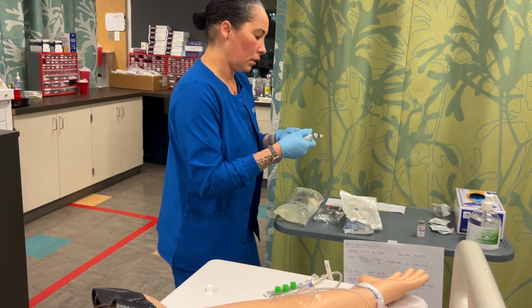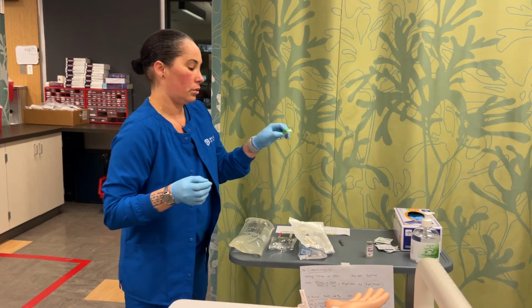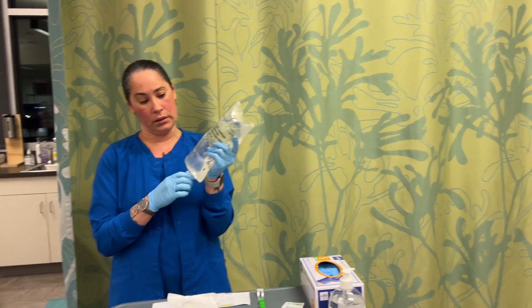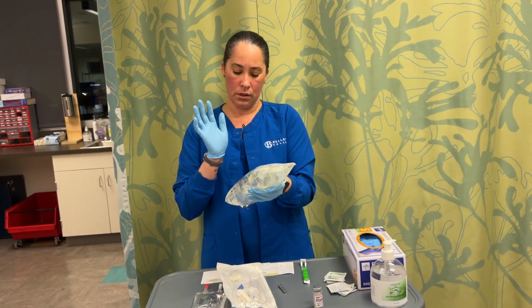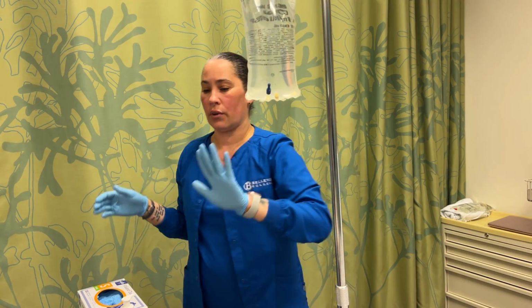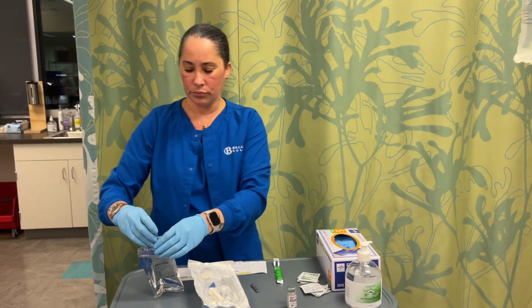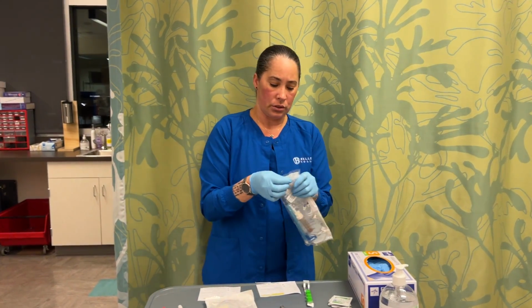All right, now that we're done with that, we are going to do our IV fluid, our sodium chloride, for hydration and electrolyte balance. So first thing you're going to want to do is hang the bag. And again, you've already educated the patient on what to expect, so if they do start feeling anything, they can tell you. And then you have your primary tubing here. So you're going to open this.